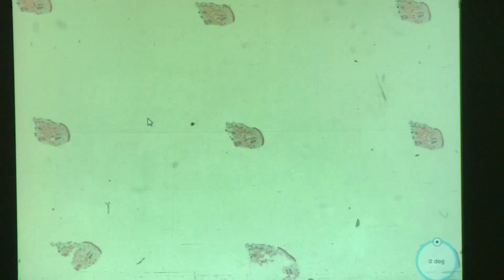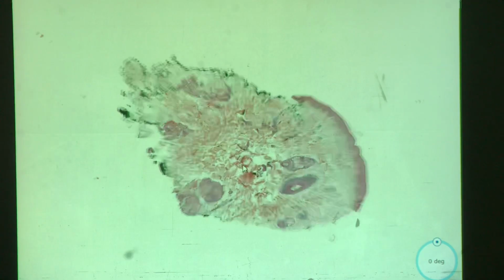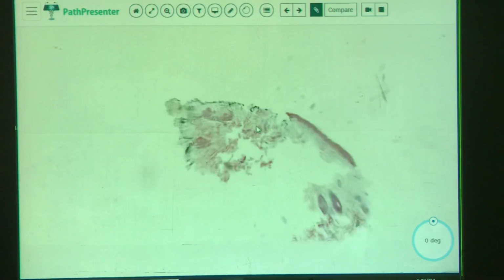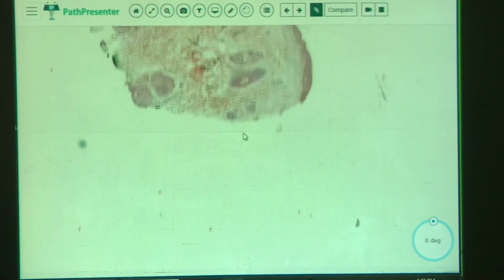Okay. So here's your slide. Wow. That's a very nice arrangement. Yeah, it's super spread out. Yes. But yeah, 3 levels of the same thing. Okay. Well, let's start from just a random place. I think they all look very similar at low power. Yeah, they do. I think this is the same piece actually. No, it's actually... Oh yeah, it's not. Okay, never mind. It's slightly different.